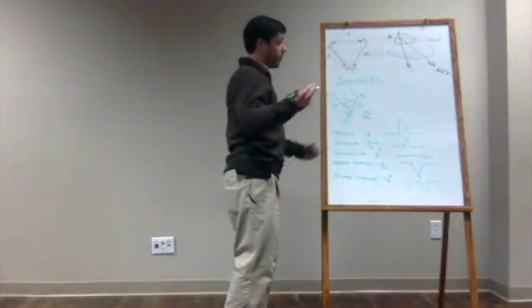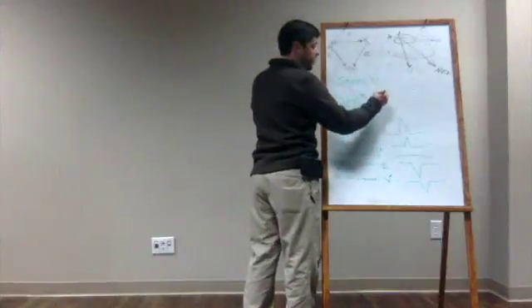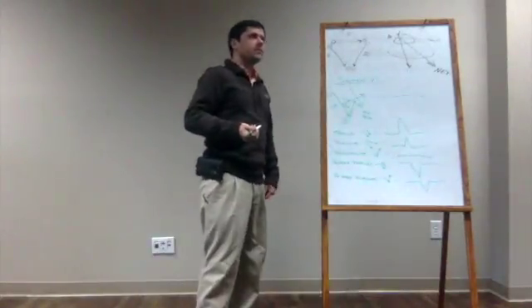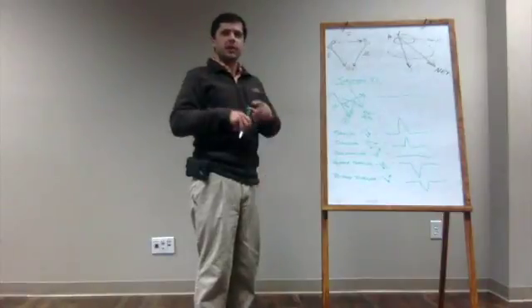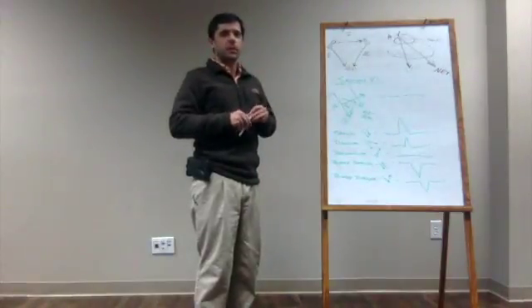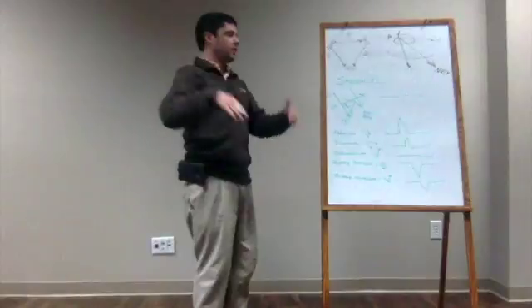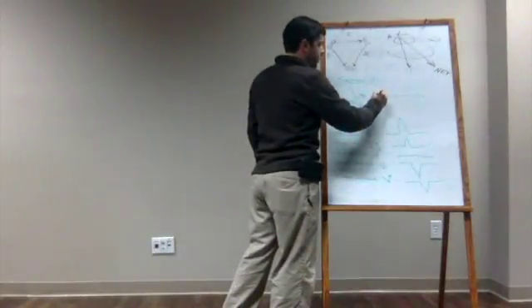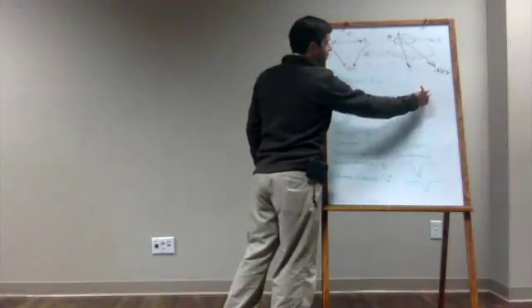Now, again, all of this is deviating from our isoelectric line. If you had a patient in asystole, would it look any different than if you hooked an EKG up to a table? It wouldn't, and that's the establishment of our isoelectric line. So that'll kind of conclude section 6 at this point.